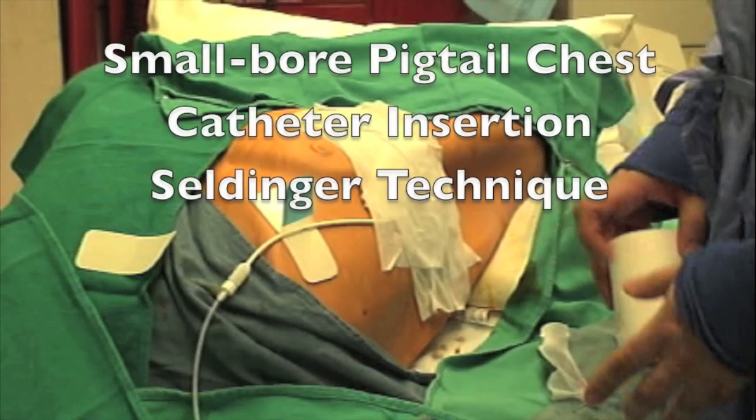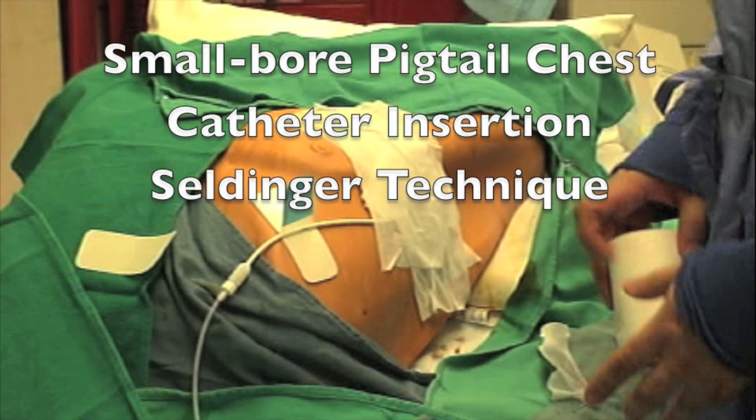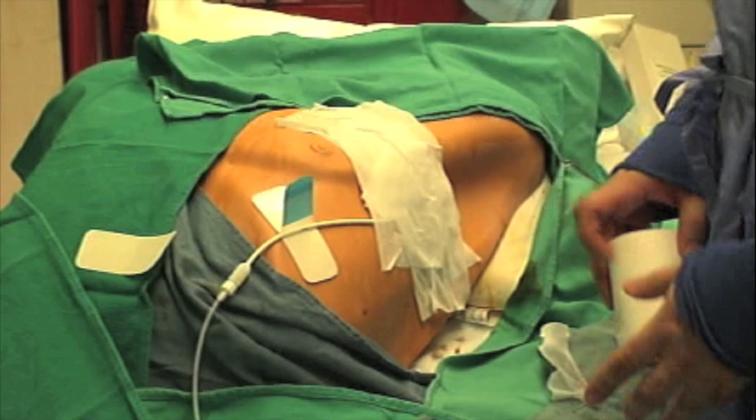This video will demonstrate the insertion of a pigtail catheter using Seldinger technique for a spontaneous pneumothorax. Please refer to the InfoNet website under Pigtail Pneumothorax for the complete written protocol, nursing orders, and written insertion instructions.